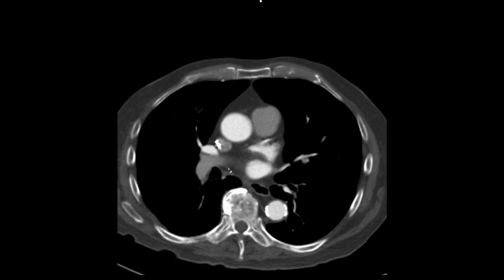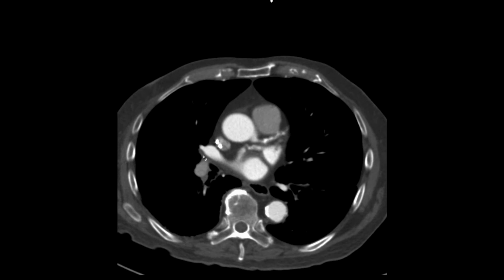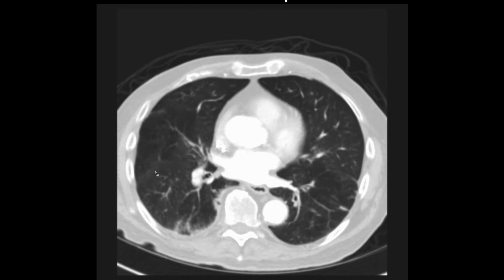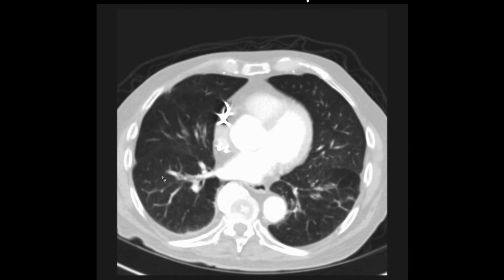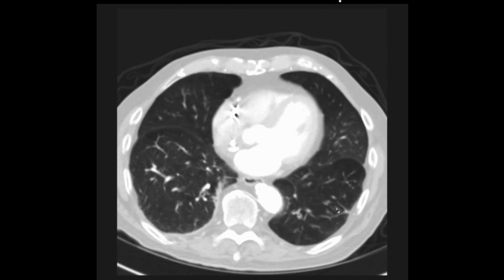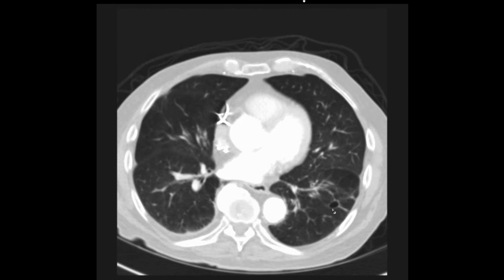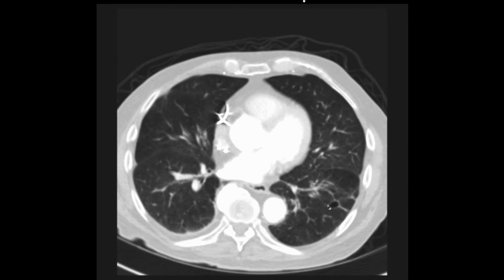The other artery that remains shut is the right middle lobe. Right here, there ought to be a vessel, but there isn't. So the right middle lobe pulmonary artery is also occluded. So I'm calling it fibrothrombotic occlusion of both. I can speculate that maybe some of these small shadows here are small foci of infarcted lung, but I don't really know that. This little cystic space is new, so one can speculate that maybe there was a little infarction of lung tissue there.